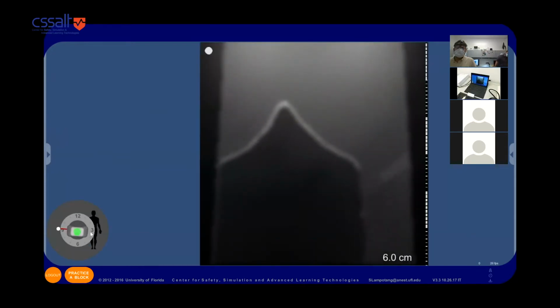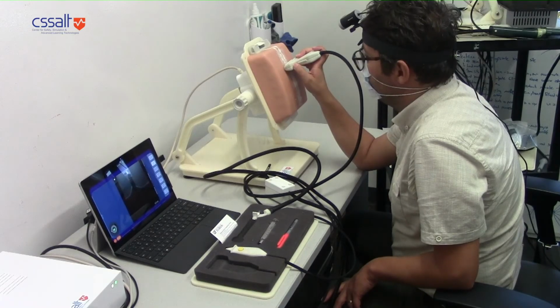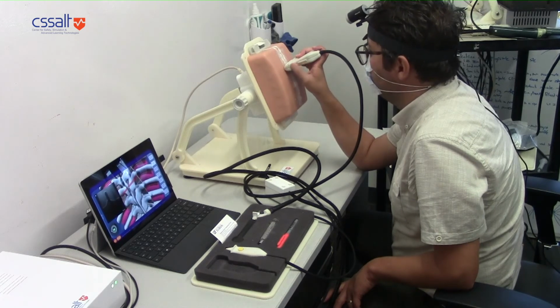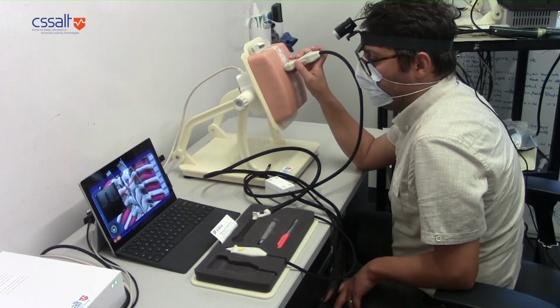Now it matches. So you see that ridge on the ultrasound probe, on the physical probe, where your thumb is at? Yes. So that's the dot on the clock, and we call that 9 o'clock now. So according to this, your probe is at 9 o'clock.